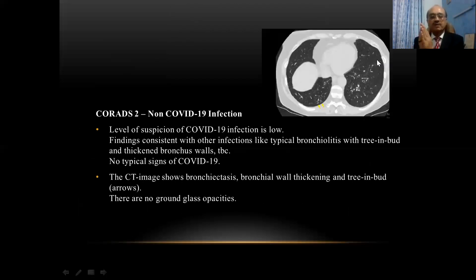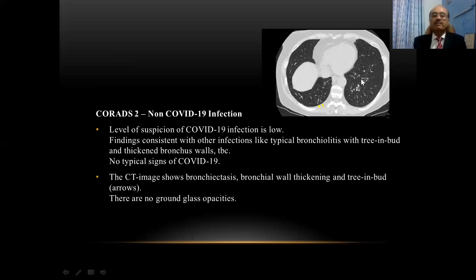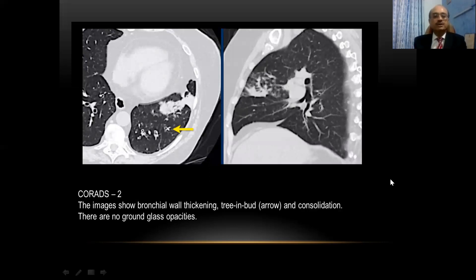CORADS 2 is again suggestive of a non-COVID-19 infection; the level of suspicion of COVID-19 is low. The findings on the CT scan can be consistent with other infections — they can show typical bronchiolitis with tree-in-bud appearance or thickening of the bronchial walls, with no typical signs of COVID-19. This CT shows minimal bronchiectasis and bronchial wall thickening with tree-in-bud appearance. There are no ground glass opacities seen, so this is negative for COVID-19.